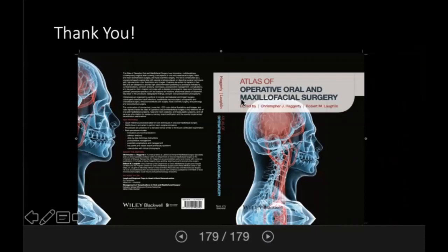Okay, so there are another two questions from Dr. Yassin. The first question says, do you recommend the usage of osteotomes to condense the bone in posterior areas in the upper jaw of D4 quality of bone? And I think the answer is yes. Usually what we recommend, as Dr. Haggerty might also confirm, is undersizing or underprepping the osteotomy to create enough space for the implant to condense the bone as you're torquing it in. You can use, of course, osseodensification tools like osteotomes or burrs, especially for the maxillary posterior sites. What are your thoughts on that, Dr. Haggerty?